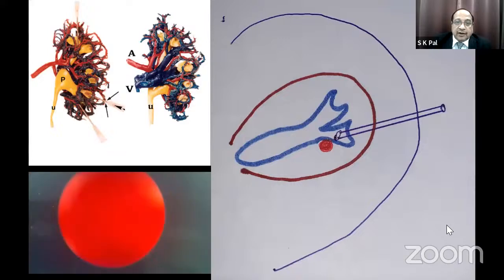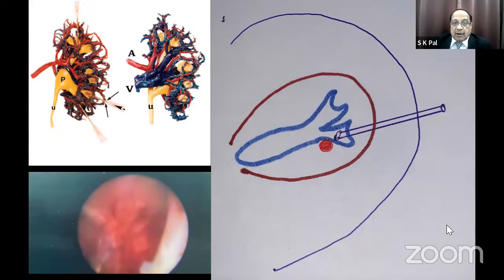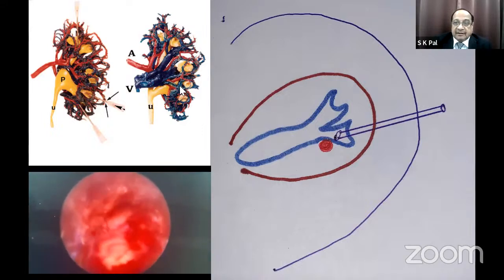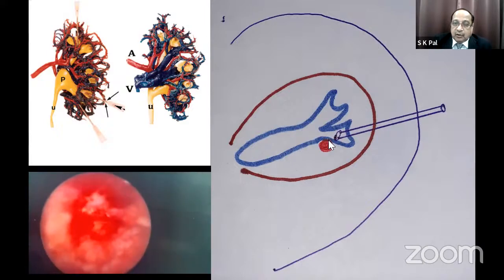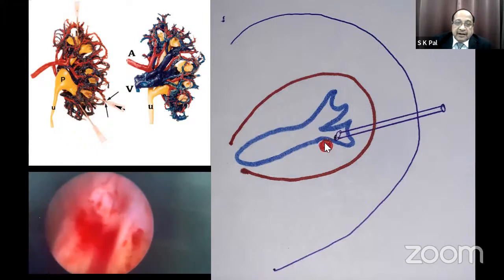And here I would like to say something about the width of the infundibulum. All infundibuli are surrounded by vessels. And if by mistake you go a little deeper, out of the system, you are very likely to go inside a vessel.